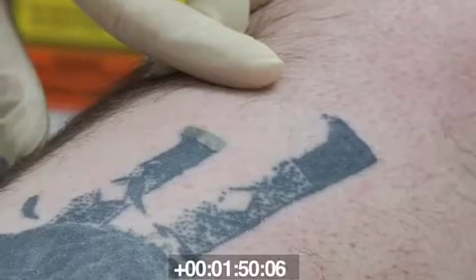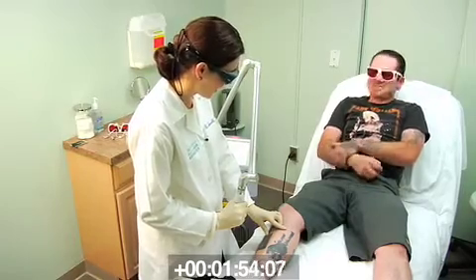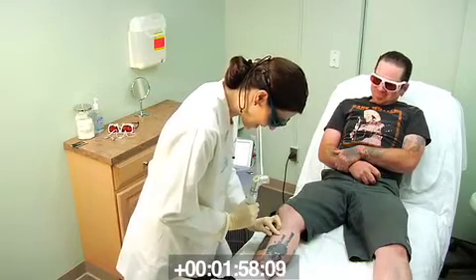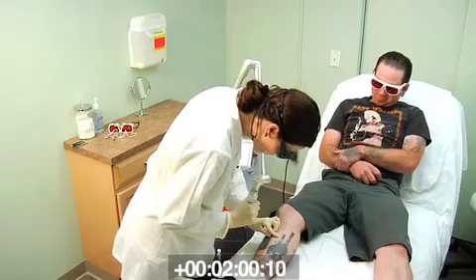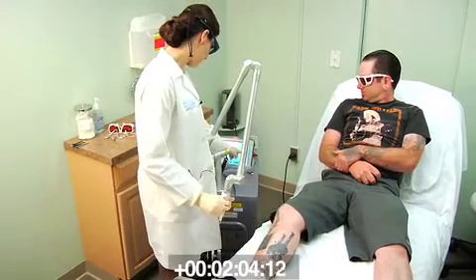Was that tolerable for you? Mm-hmm. Was that pleasant? Pleasant wouldn't be the word. Pleasant wouldn't be the word, because I wouldn't want the patient to tell me it was just fine and they didn't feel anything, because that would mean I'm just too low. I'm going to go up just a smidge more.